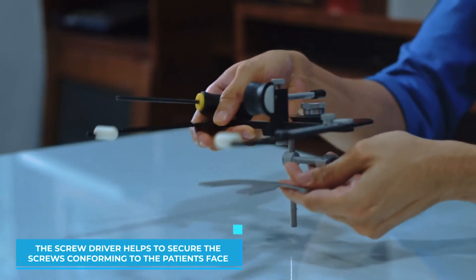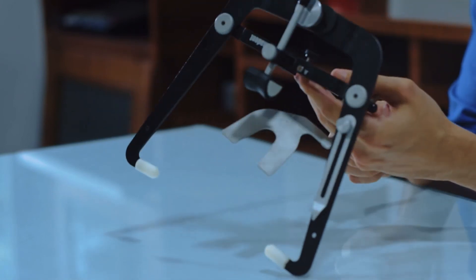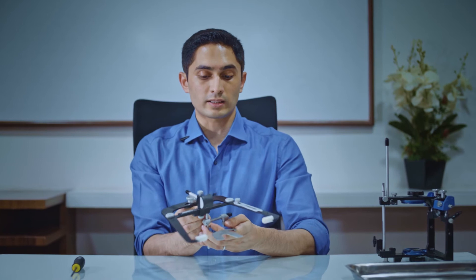We tighten it to a nice position conforming to the patient's face and lock it in place. As you can see I'm struggling a bit trying to do it without an actual patient. Once this is all done, you can unscrew the assembly and take it to the articulator.